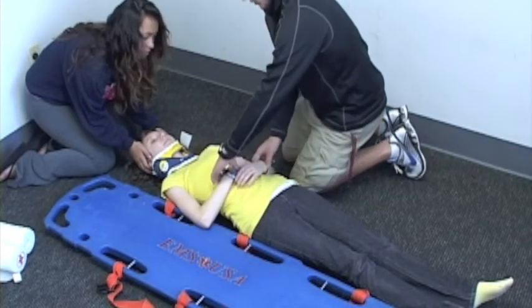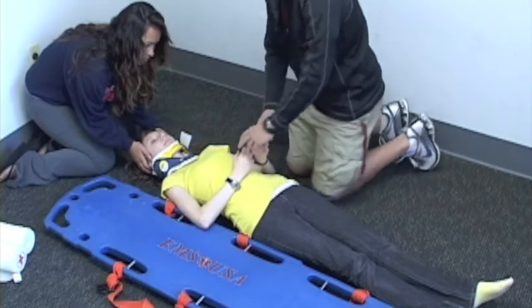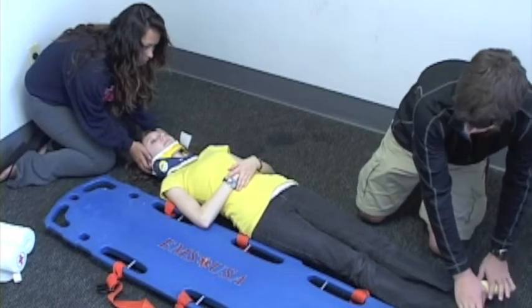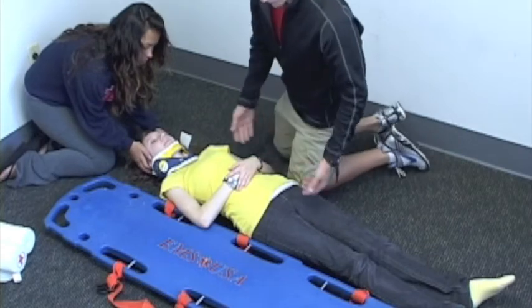I'm going to go ahead and assess PMS on my patient. I'm going to get a pulse. Go ahead and squeeze for me, ma'am. I'm going to get a pulse. Go ahead and push down and pull up for me, nice and gentle. So I've got my PMS. I've got my collar on. I'm going to go ahead and put her on a board.